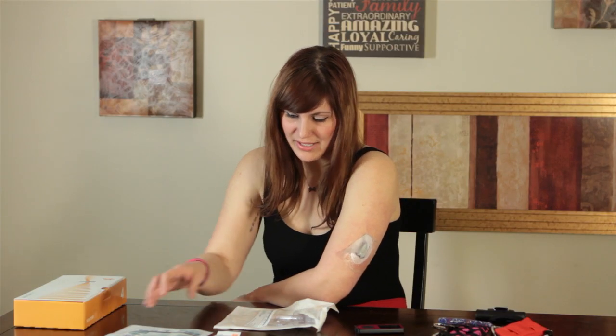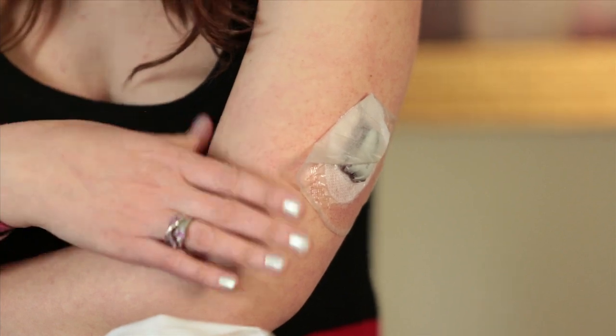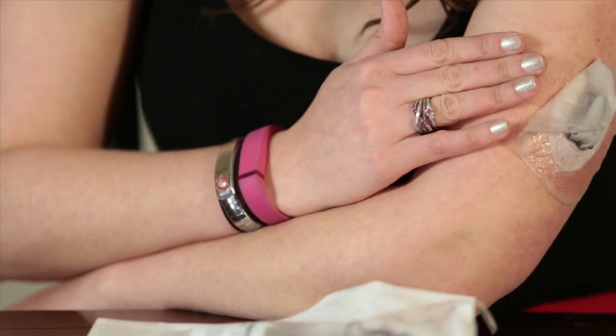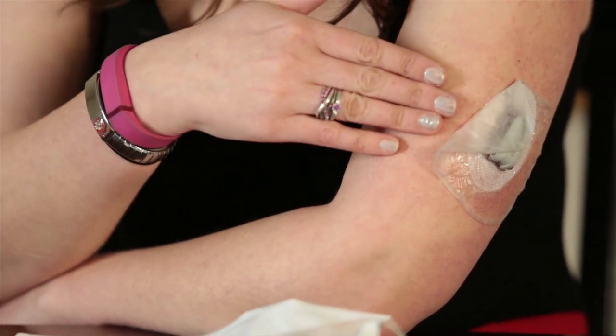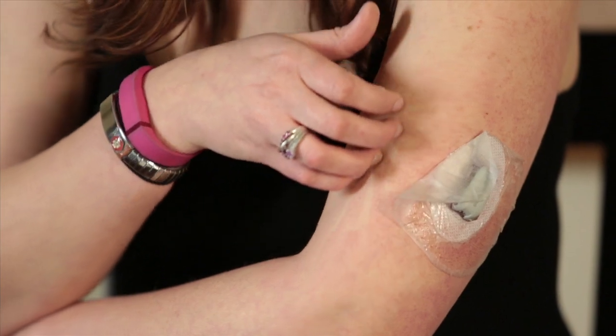Whenever I had it in for two weeks, I used Tegaderm to hold it on so it stays on longer, because the tape that's on it, while it's pretty good, once you get to around the seven-day mark it's starting to peel up. Some people use Tegaderm, some use something called rock tape — all these different types of breathable tapes. Try out what works best for you if you want to keep it on longer. It's not injecting anything; it's not like an insulin pump giving you insulin, so there's nothing there that's going to cause irritation or infection.